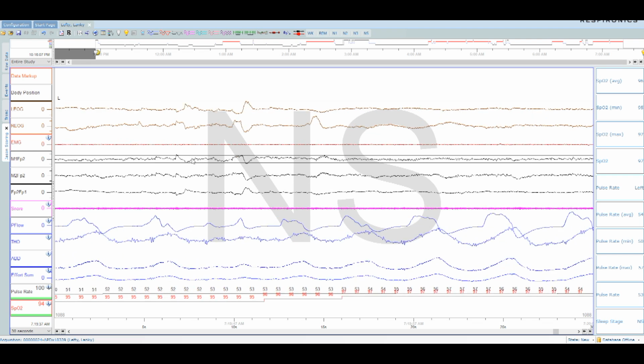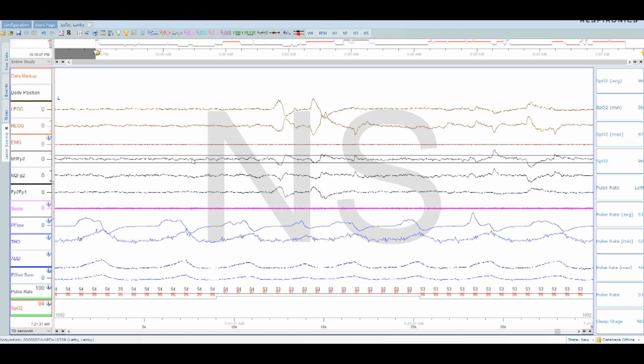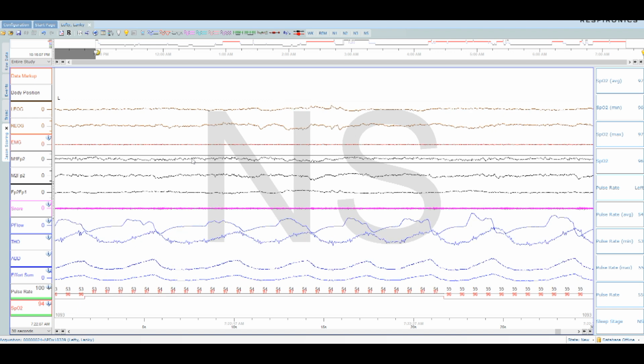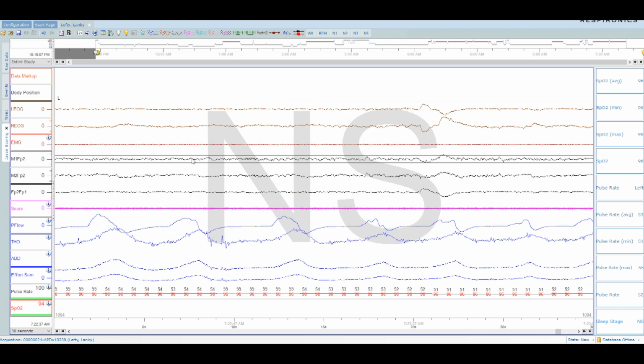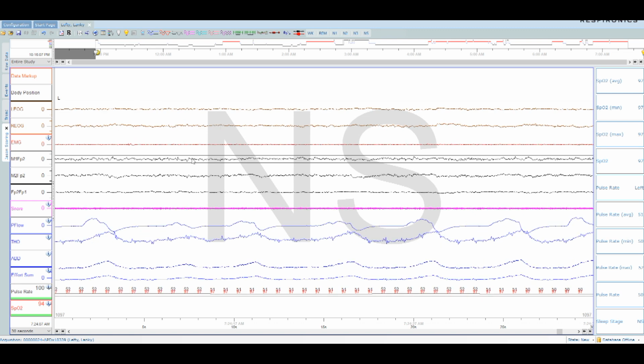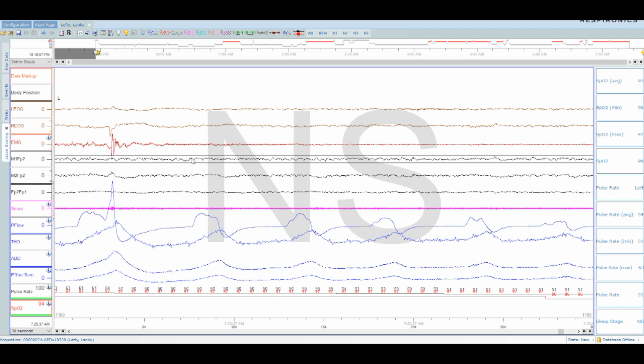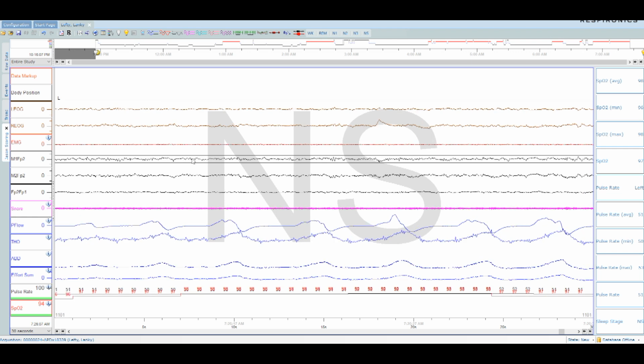There's a lot of patterns that you can pick up in breathing and what it looks like during the stage of the subtle respiratory changes. And then even EEG is different in people. You'll start to notice differences when people are taking specific medications, and how it affects their EEG and how it affects people differently.